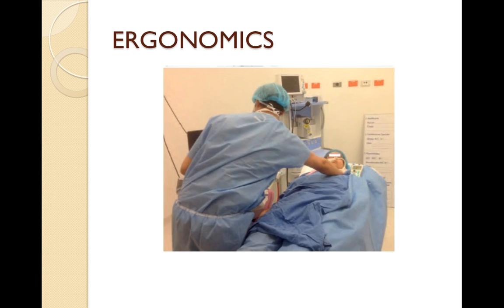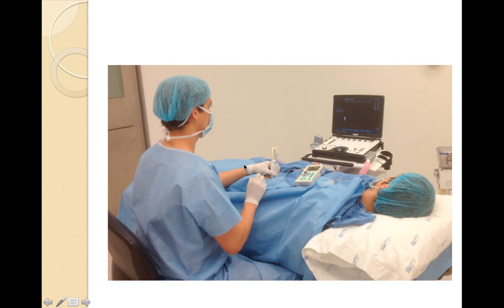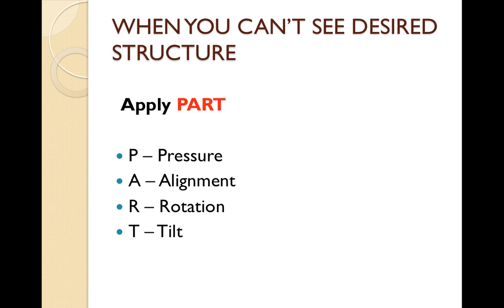Ergonomics, this is important. If you start doing like this, there will be a problem to your back. So it should be in your vision, and you must be comfortable. Here is the way you should use it. You must be comfortable. Your machine should be in your eyesight, and you should not have to twist or tilt to give any block. So this is the right technique.